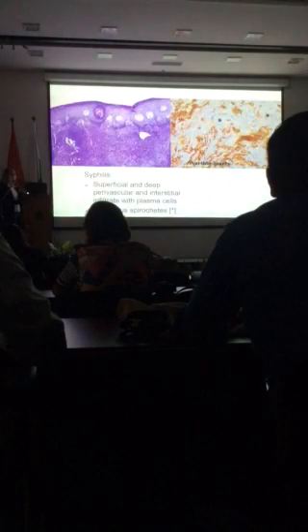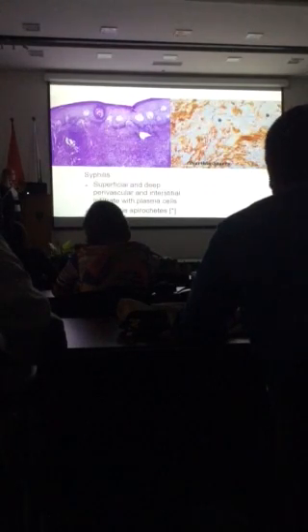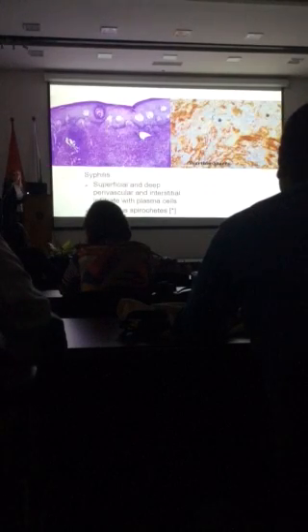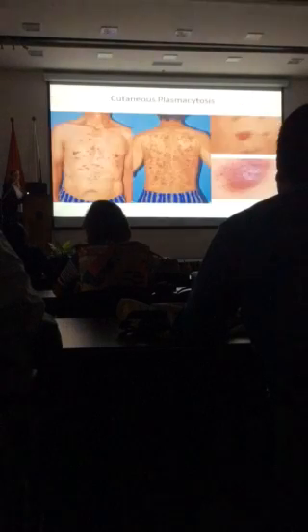Here, this is basically a uniform population of plasma cells. I want to point out that I have seen 2 patients who were referred for B-cell lymphoma, but this patient had actually syphilis. You do find, on the Warthin-Starry stain, these are the spirochetes, so you still have to consider syphilis. So in all my patients, I check RPR.